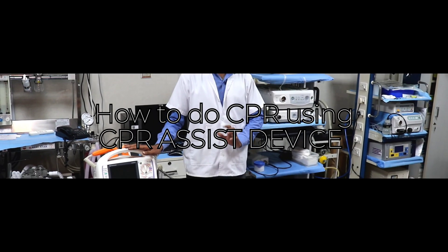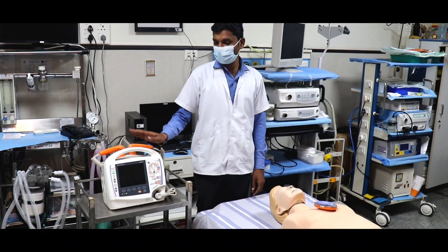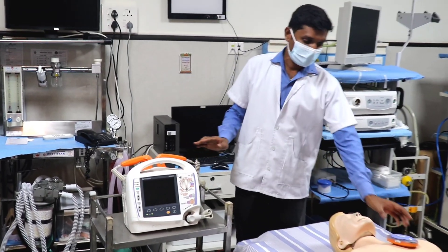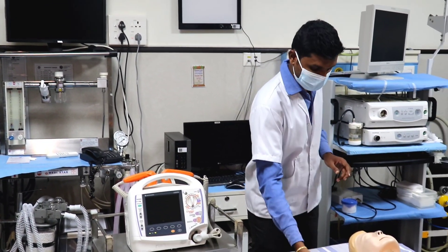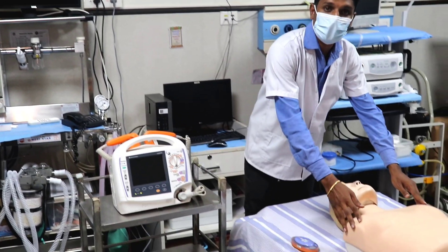In this video we are going to show how to give CPR using a CPR assist device. We are using a defibrillator, a CPR assist device which connects via Bluetooth, and a half-body mannequin.